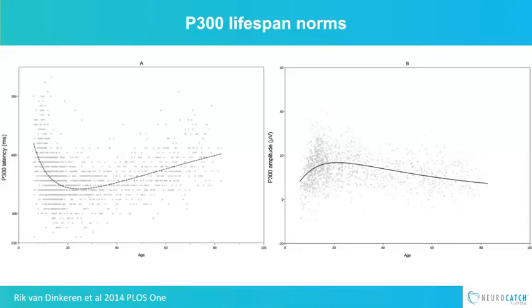Clinically important if somebody's had a bad sleep, or if they are drinking coffee before or after. We know these factors affect the P300. This is really based on how's your information processing today, and how's your attentional processing at the time of testing. So if you want to optimize a P300, you would make sure people are awake and alert and aware and in their best possible case, and you would see those effects much more in the P300, whereas an N100 would be a basic sensory processing related to hearing and that sort of thing.